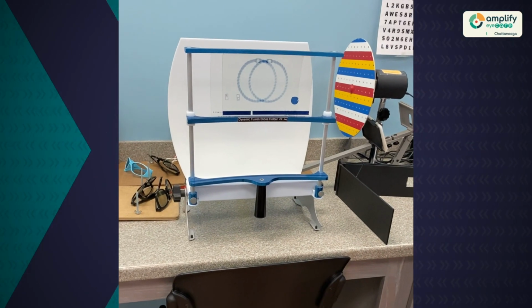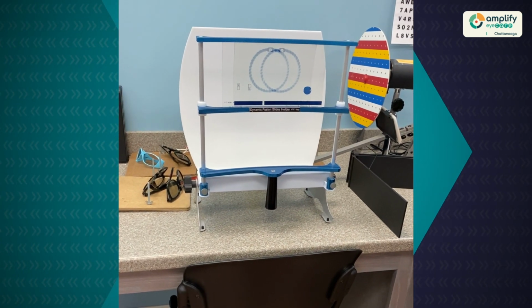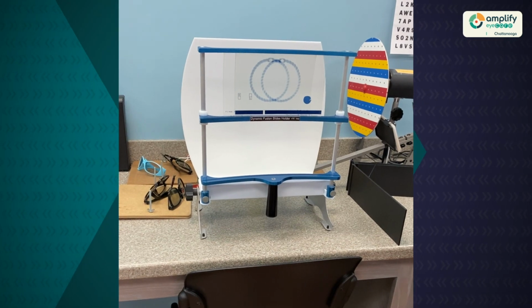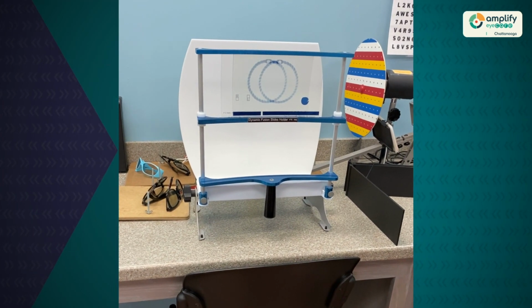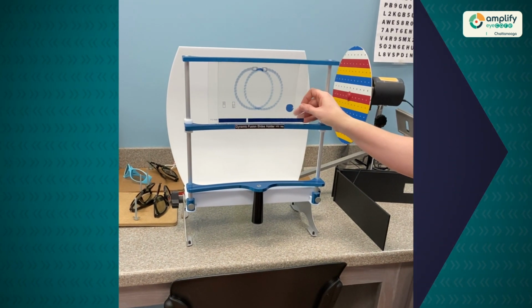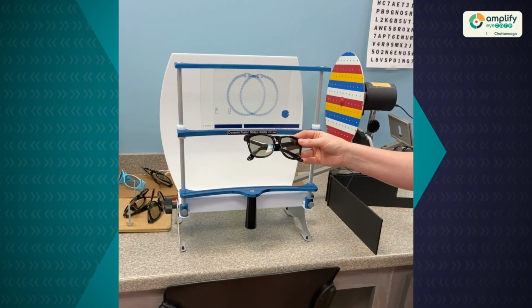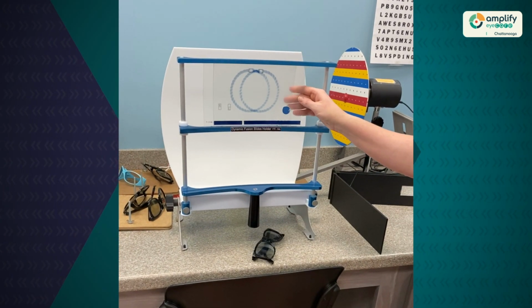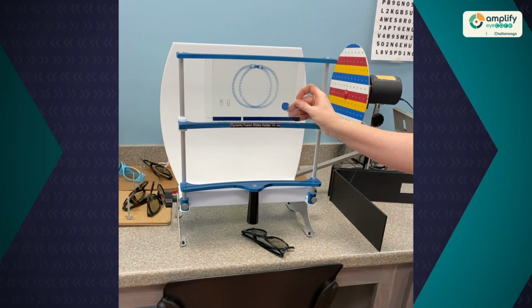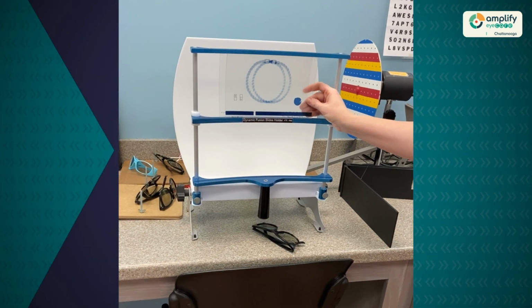Some of the procedures that we utilize in the therapy room for acquired brain injury or other neurological conditions will be focused on the main diagnoses that we see in this population. So one of the things is going to be working on eye teaming. One of our most common procedures is Vectograms. This is where we're able to use polarized targets while the patient's wearing the polarized glasses. And we manipulate the targets and it will make them look like they're moving closer or farther to the patient. So we're working on what's called convergence or divergence of the eyes.